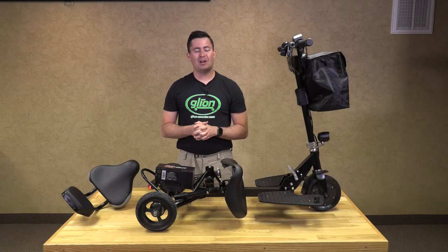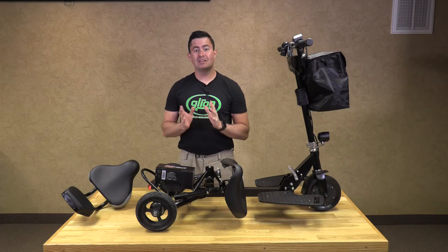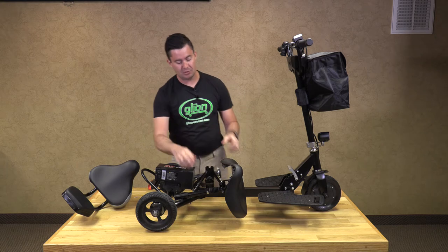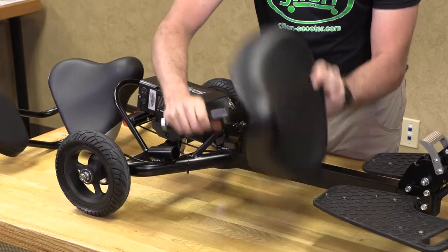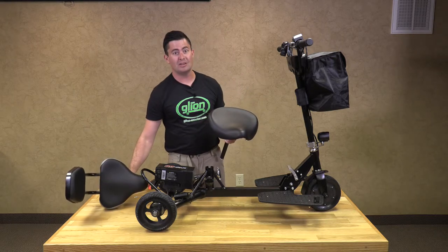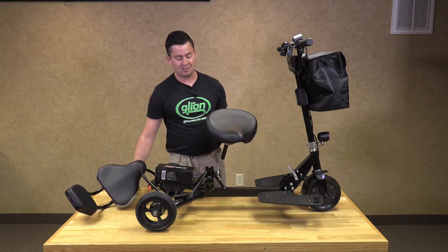Now I am going to show you the two travel seat options that are sold separately. The Deluxe seat, which I have been showing you, comes standard, but we do have two options: a standard bicycle seat, and a bicycle seat with a back. Now I am going to show you the installation of these travel seats.